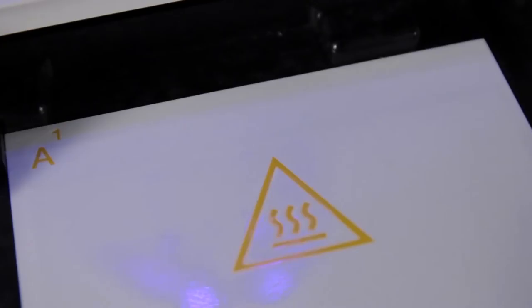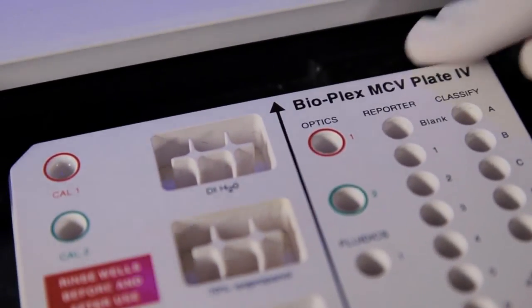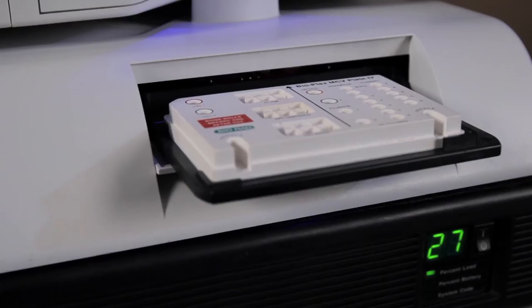Now, place the MCV plate on the XY platform with the black arrow on the MCV plate facing towards the array reader and click Eject Retract to retract the plate.